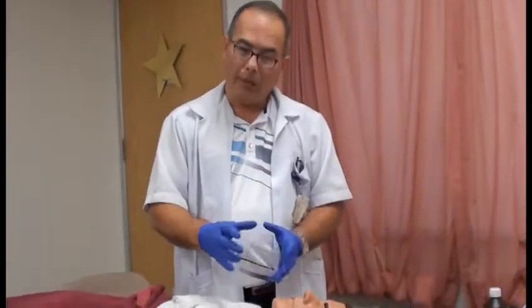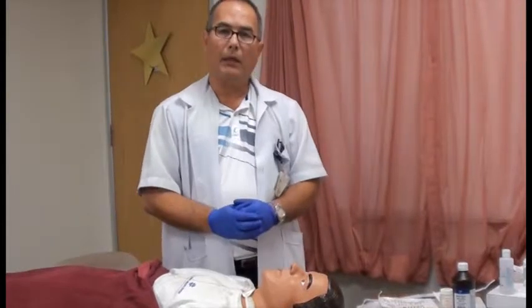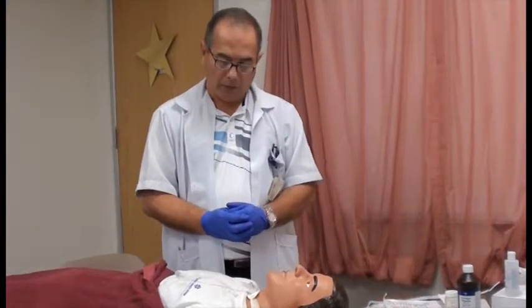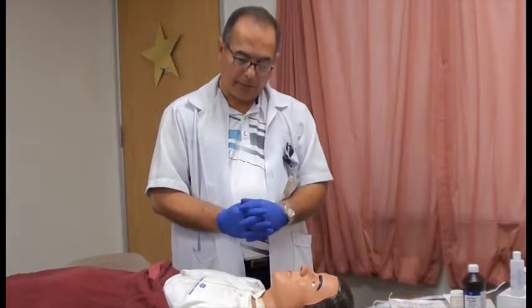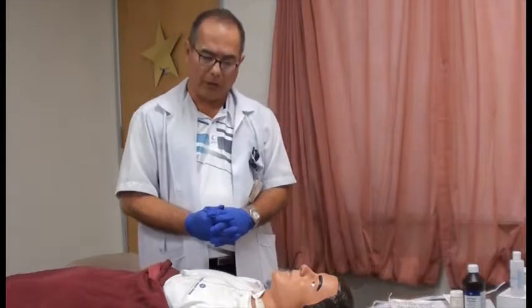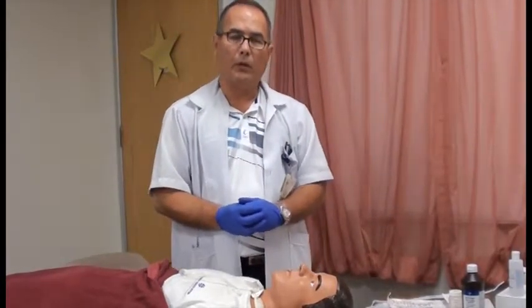So why are we doing tracheostomy care to begin with? Well, the tracheostomy site itself is not a sealed system, it's open, so every time the patient's coughing, he's producing phlegm or mucus, and that builds up around the trach site, and of course that can always be a source of infection. So we have to make sure that it is clean, and if the patient has heavy mucus production and a lot of coughing, then this process might have to be done more than once a day.